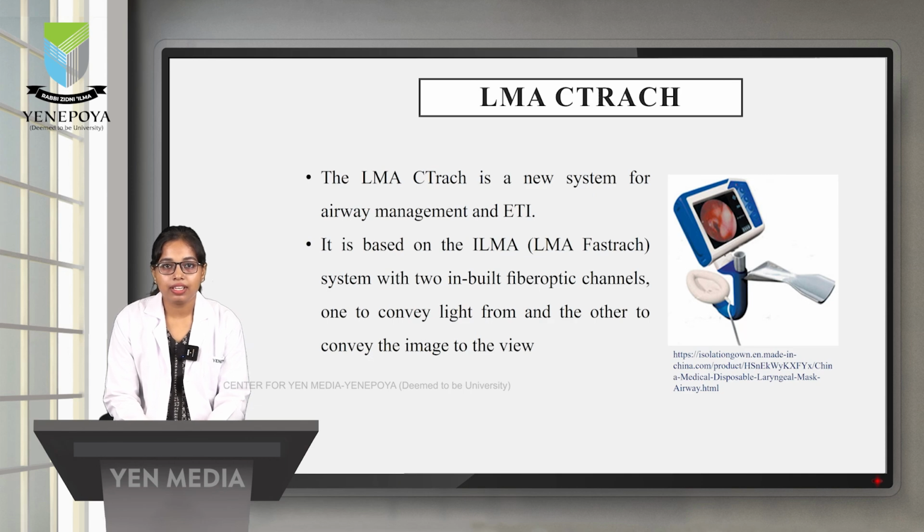Next one is the LMA C-Trach. The LMA C-Trach is a new system for airway management and endotracheal intubation. It is based on the intubating LMA system with two inbuilt fiber optic channels, one to convey light from the light source and the other to convey the image of the view.